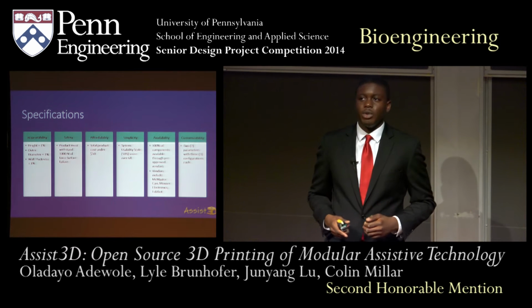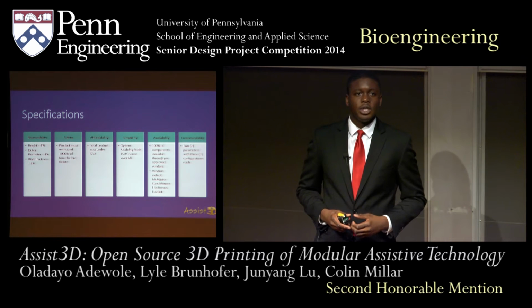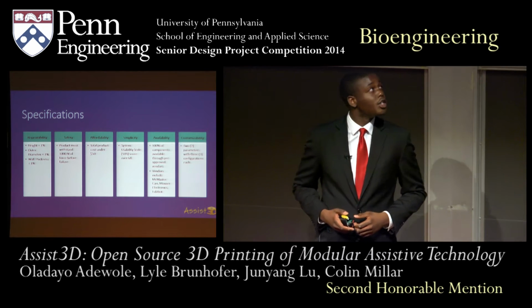We also want to make sure that our button was customizable. Because kids will use different parts of their bodies to activate it, we wanted to make sure that they would be able to use their leg, their head, or their arm. We also ensured that we had 3 different sizes: small, medium, or large.